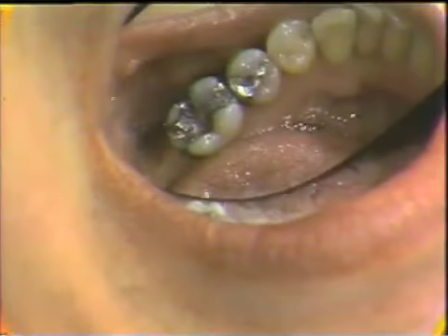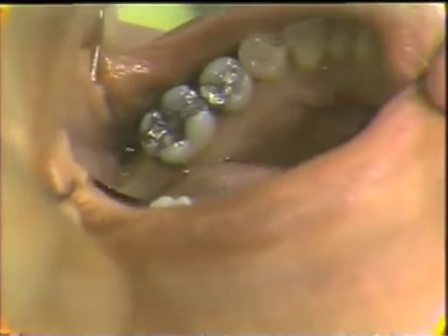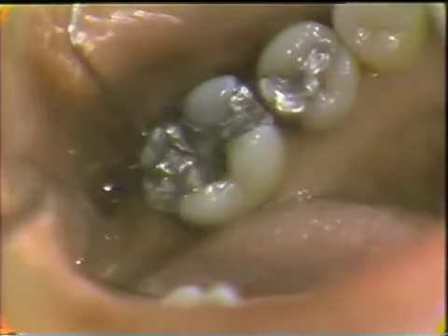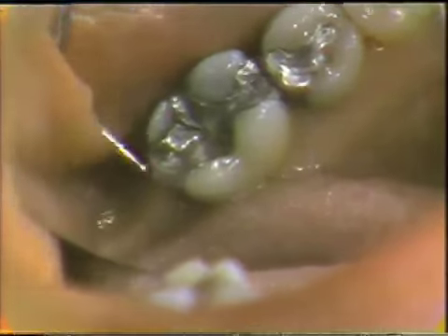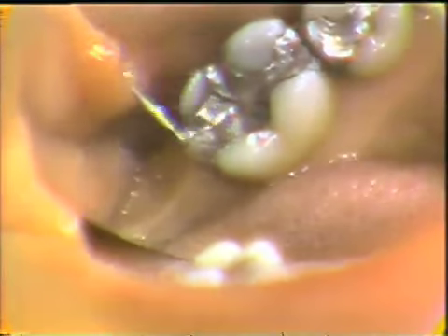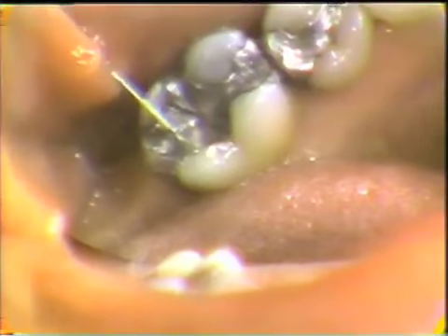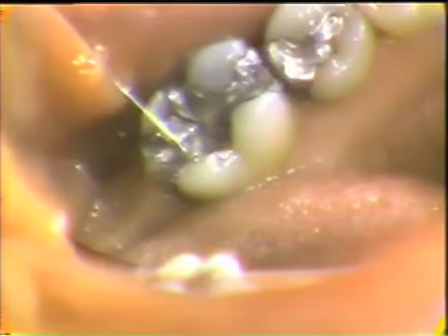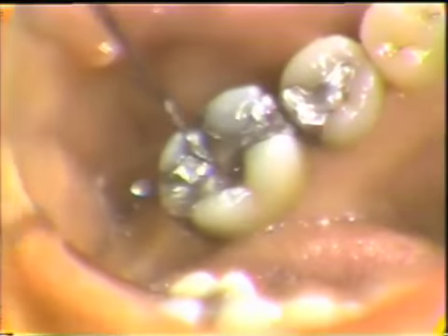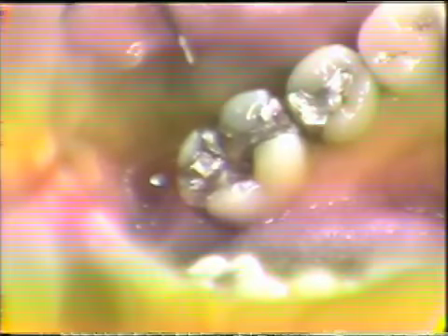What we're concerned with here is that if a clasp is resting on the distal aspect of the tooth with an occlusal rest in this area here, that there is enough room for the minor connector to come up and be attached to this occlusal rest. There should be enough room with the teeth together also in occlusion so that we have an adequate amount of room or adequate clinical height to the abutment crowns for the primary clasp units or the direct retainers.